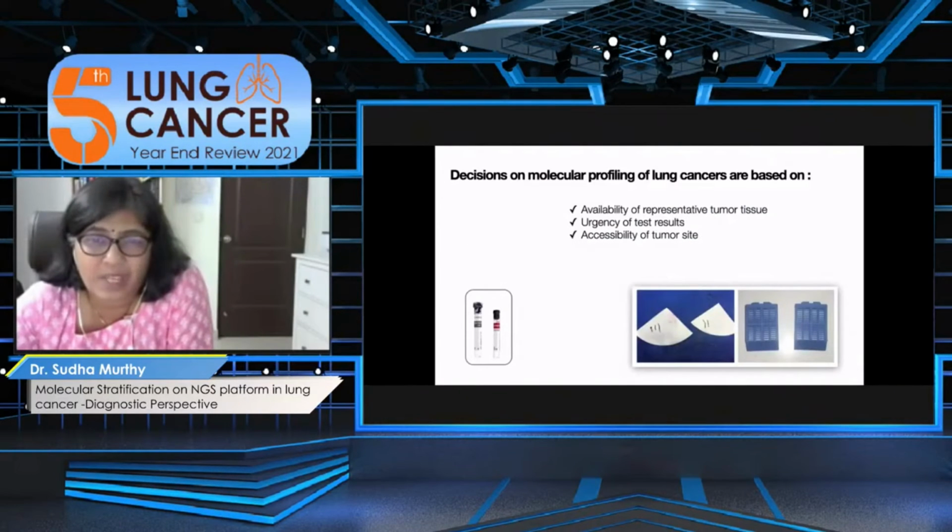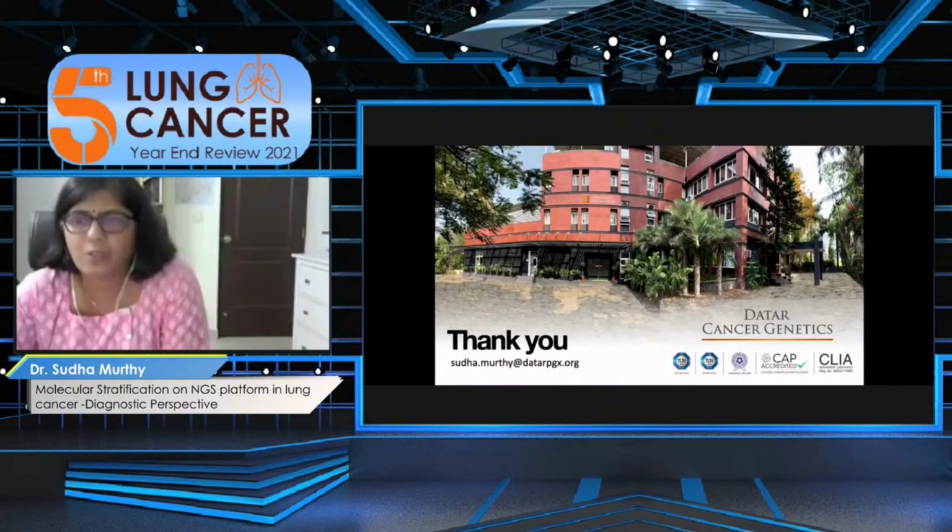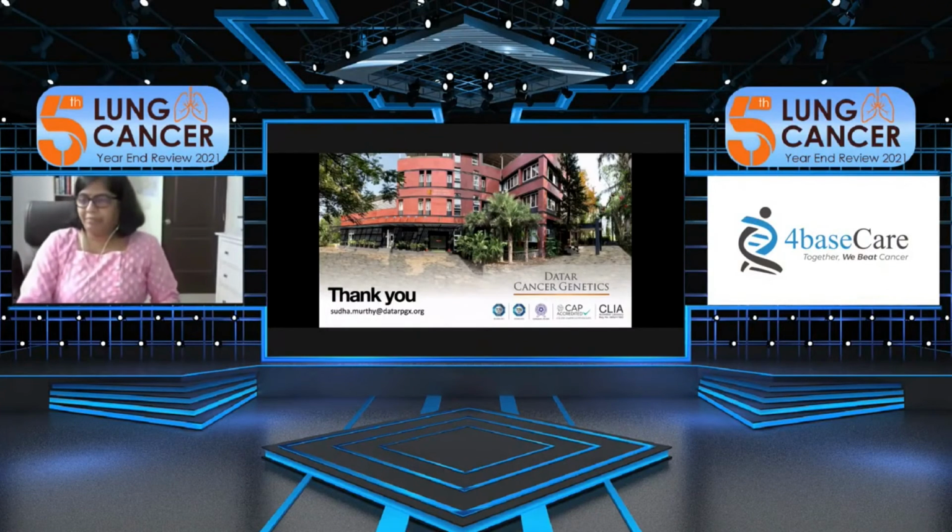So decisions are based on availability of representative tumor tissue, urgency of test results, and accessibility of tumor sites. So I'd skip this in the interest of time. Turnaround time and quality are the key to successful NGS. Thank you so much for a patient hearing.